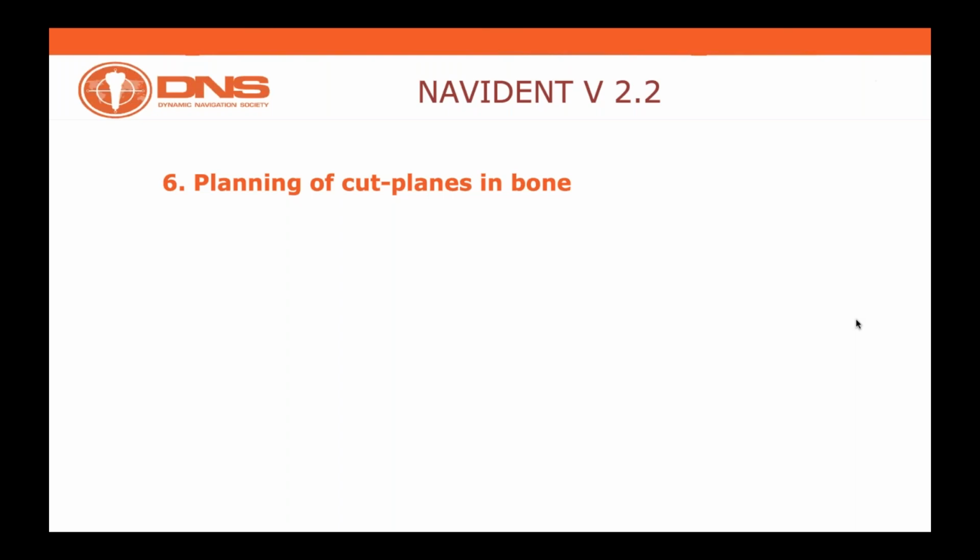And I do have another question by Dr. Bara. He asked, do you think that in the actual situation, working with Navident can decrease the risk for infection or transmission of COVID, with less surgery, indirect vision?